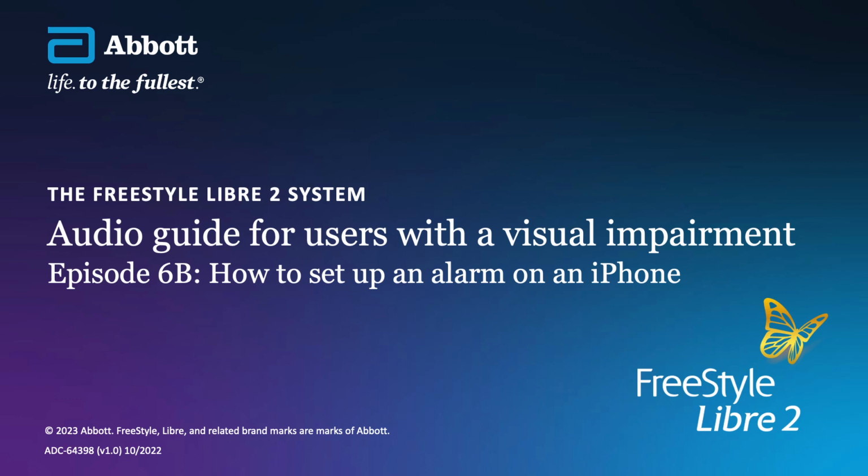Low glucose alarm. Selecting the low glucose alarm option will take you to the low glucose alarm screen. At the top of this screen and to the right-hand side is a switch button, off. Selecting this will turn the low glucose alarm on. Note that turning on the low glucose alarm will automatically turn on the signal loss alarm, and a pop-up box will appear prompting you to OK this.